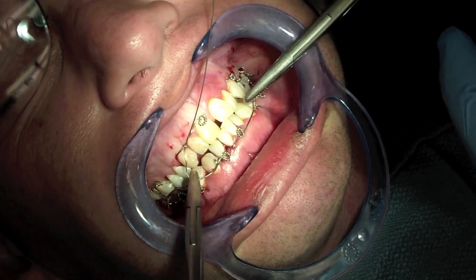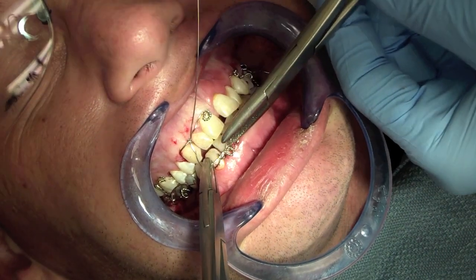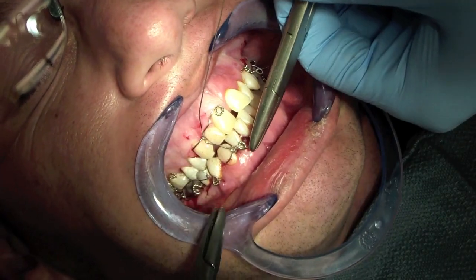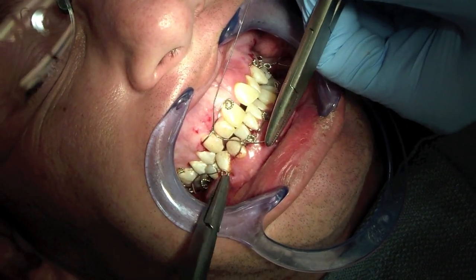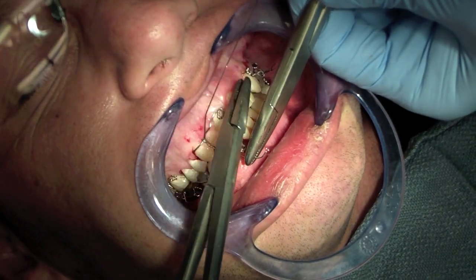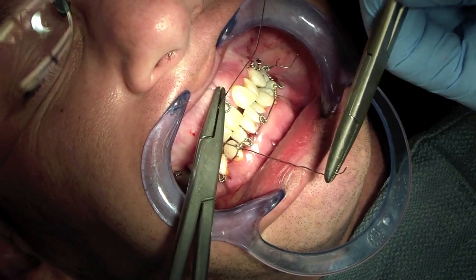Now this is an interesting situation because I kept breaking the wire and I think the camera fell off the bracket. It didn't hit the patient and I didn't break my camera. So this is the best footage I have and it's a great learning experience because it shows what not to do when twisting the wire shut.